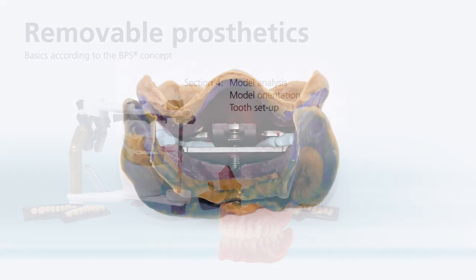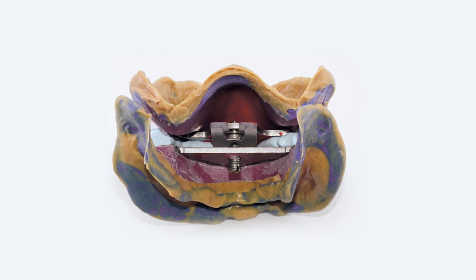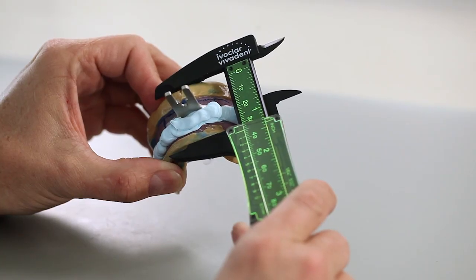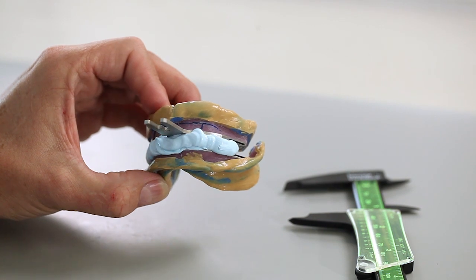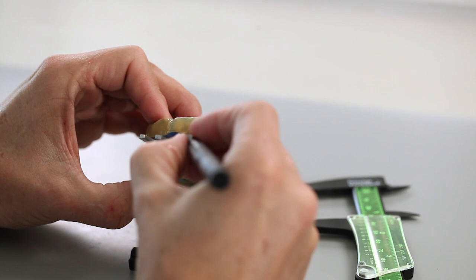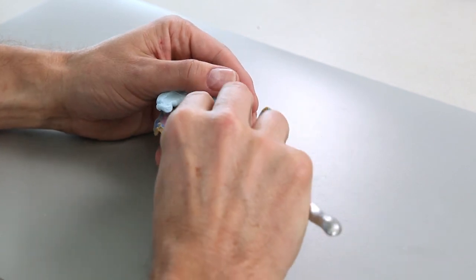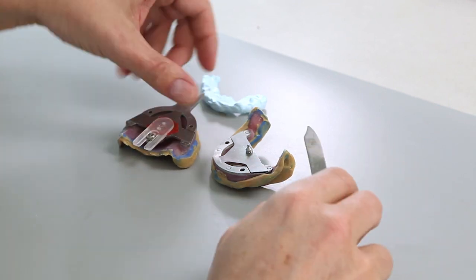The dental technician receives two functional impressions, which are secured in the correct occlusal height and centric position by means of the intraoral registration of the gnathometer M. Measure the patient-specific intervestibular distance in the anterior region and note it down. After that, carefully separate the functional impressions and carefully remove the support pin registration plate.